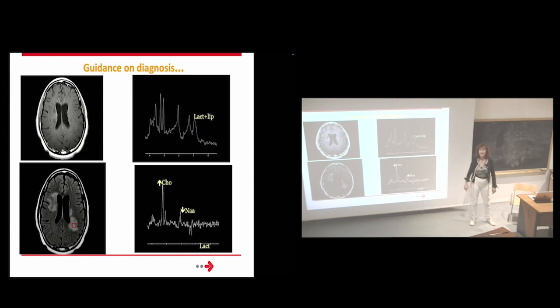What is the spatial resolution when you do spectroscopy? You show a voxel, yeah. But how do you define a voxel big enough to have enough precision in your spectrum? In fact, here we are at 7 Tesla. That is to say that the resolution is 0.2 millimeter. So that's the basis element.